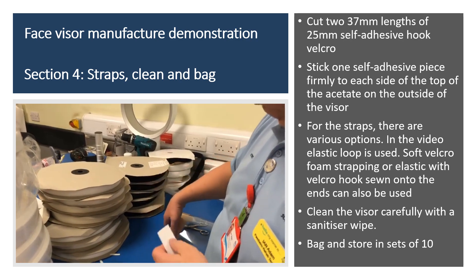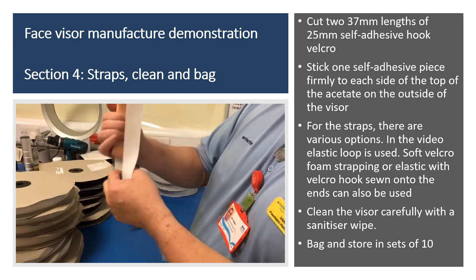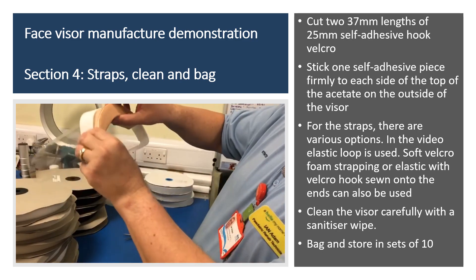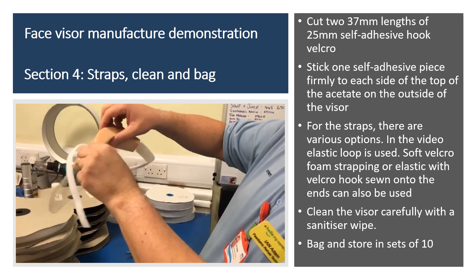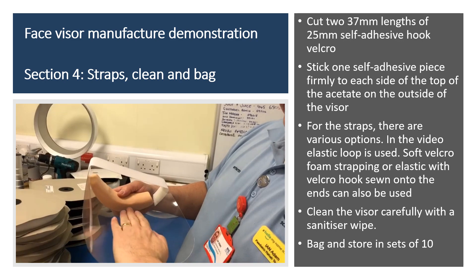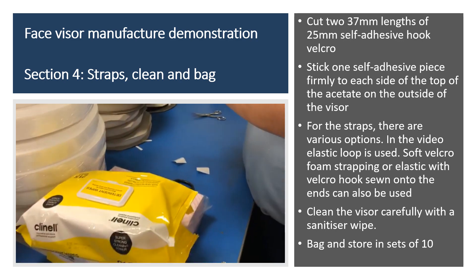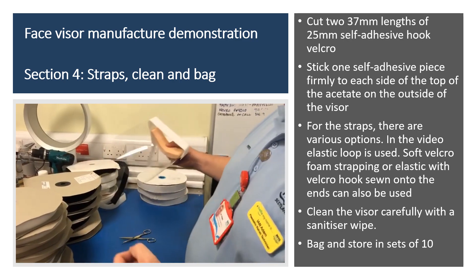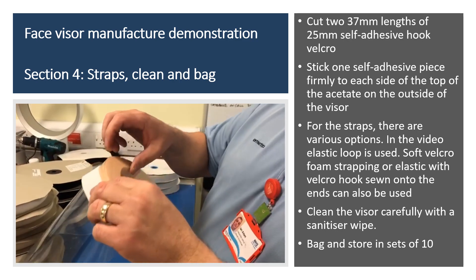There's plenty of elastic, both black and white. Basically just stick it on there, bring it round, and that forms a shape. Leave the strap long anyway — whoever's using it can cut it down. Then to clean it, using the wipes, clean all over the plastic or acetate because it'll be a little bit static. Then just put it in a bag — we're going to bag them up in turns.